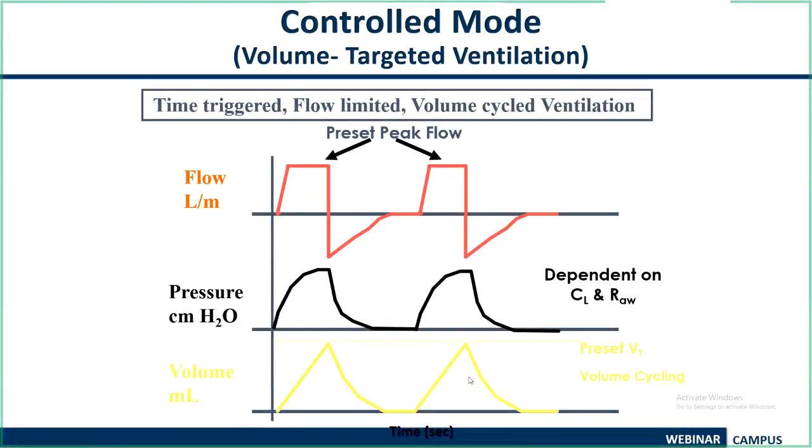It may be available in an anesthesia ventilator or a bellow ventilator. So here what you have to understand is the difference between a volume control mode and a pressure control mode. Here you can see the volume is limited. Suppose I am setting a volume of say 400 ml. Every breath the machine will deliver 400 ml. But depending on the compliance, meaning the distensibility, so how easily you can expand the lung in simple terms. If a lung is very compliant, your pressure will be minimal. So the pressure will depend on the lung compliance, but your tidal volume will be constant.